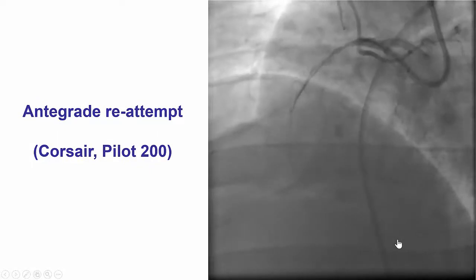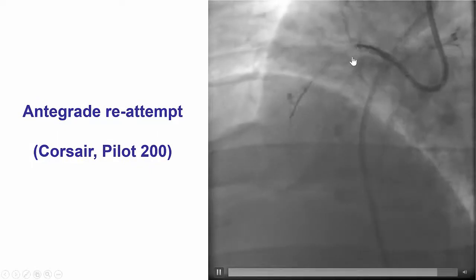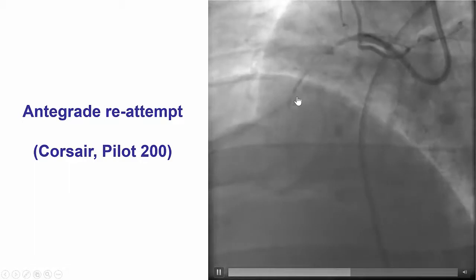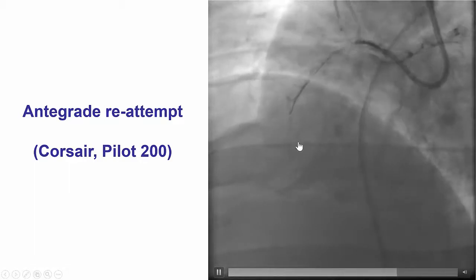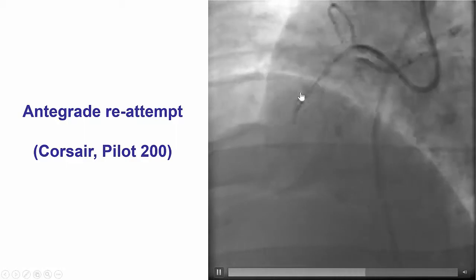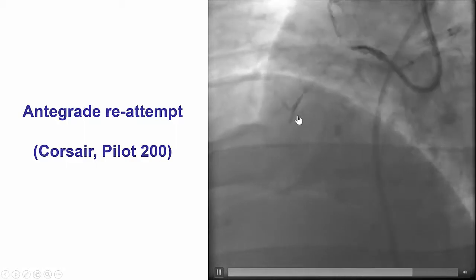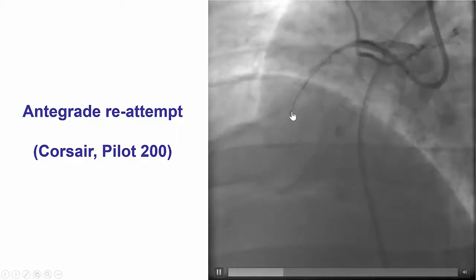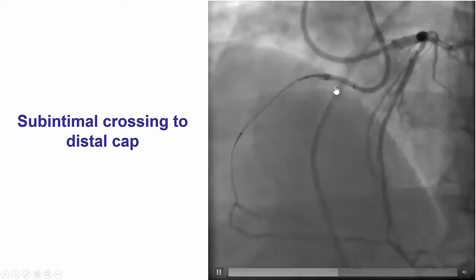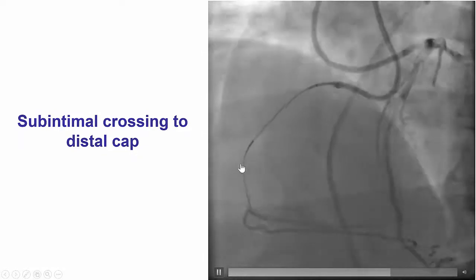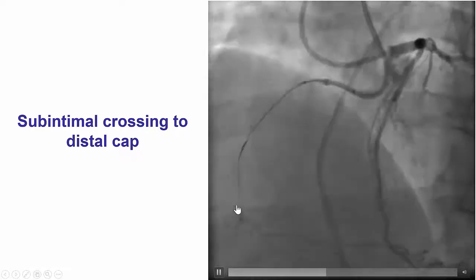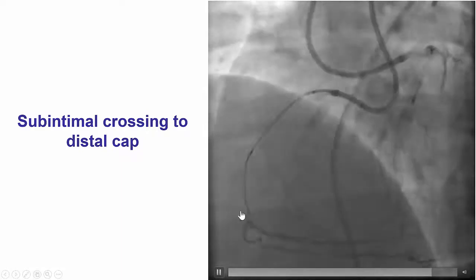We went back to an antegrade attempt. We used the Corsair microcatheter and the Pilot 200 wire and now seemed to be going in the right direction. It looked like we had resolved the ambiguity and the wire appeared to be within the true lumen in the middle part of the right coronary artery. However, with further advancement, the wire went subintimal and we had a subintimal wire close to the distal cap.